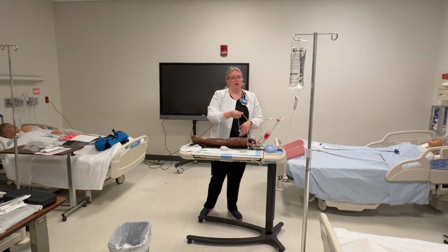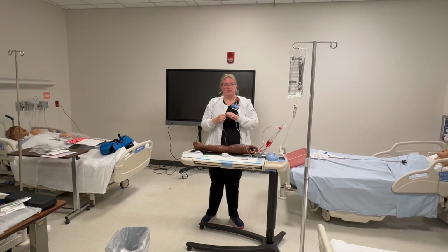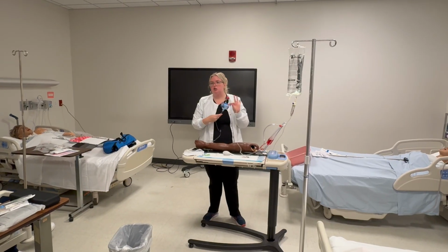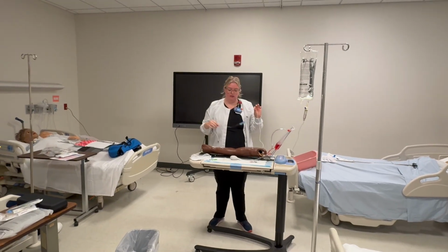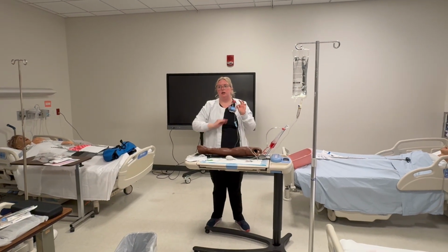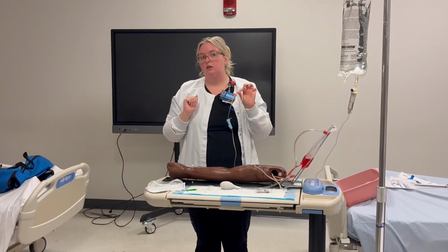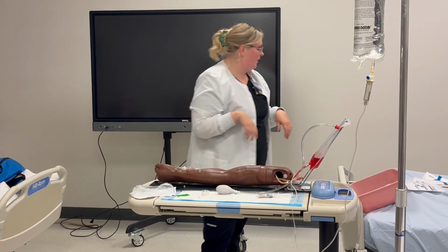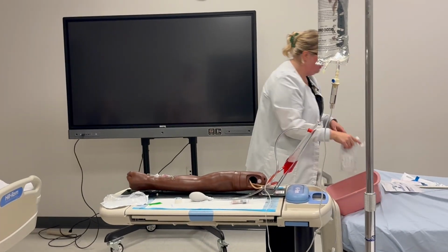Also, we wanna chase our lines. Maybe this got pressed on accident. This is another clamp. So chase your lines, make sure it's not something simple and silly. This is also a clamp here. Maybe you clamped this and you forgot. So check and chase your lines first. Okay? Anybody have any questions so far? Okay. All right. Now I'm gonna do my secondary bag.